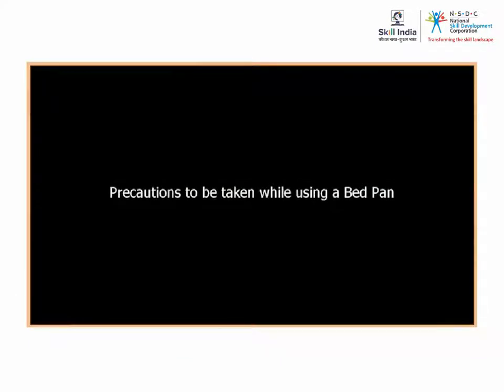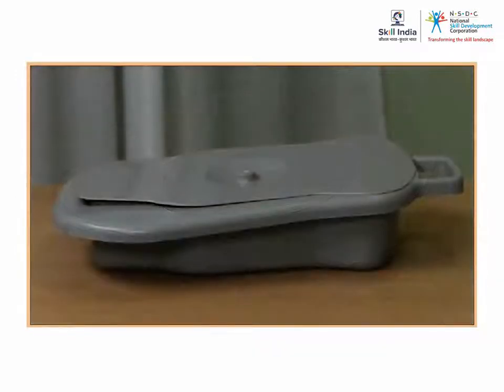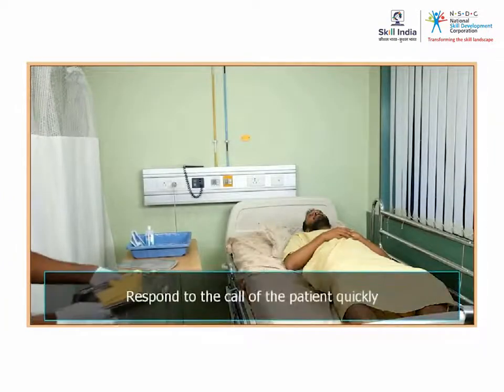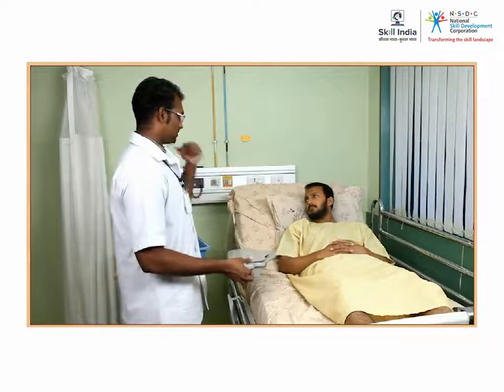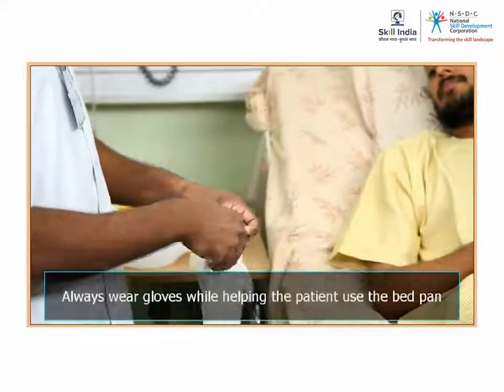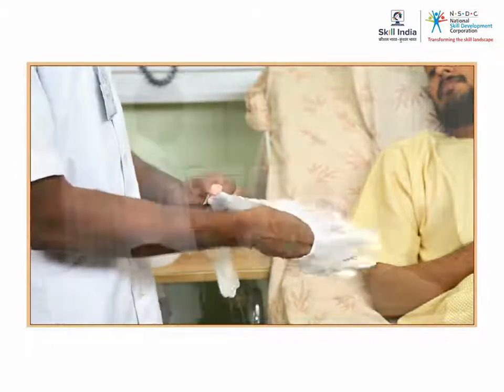Precautions to be taken while using bedpan. Bedpans are made up of metal, hard plastic or glass in some cases. Respond to the call of the patient quickly. Explain the process politely before placing the bedpan. Always wear gloves while helping the patient use the bedpan.